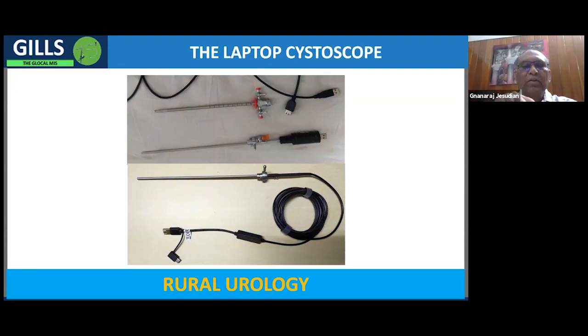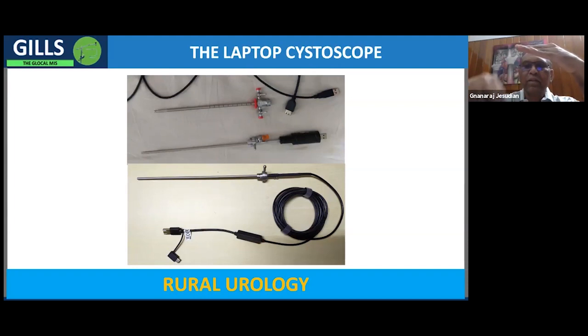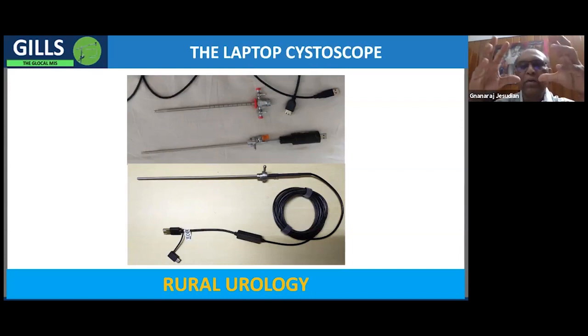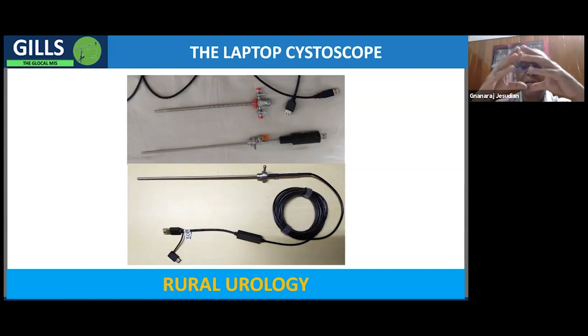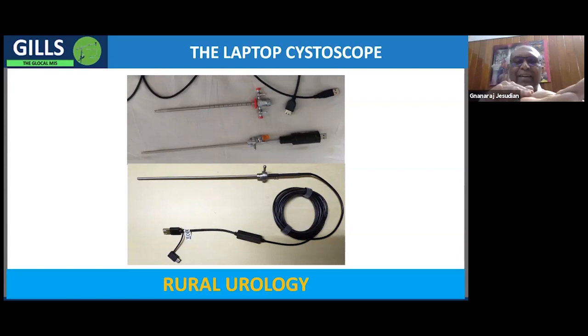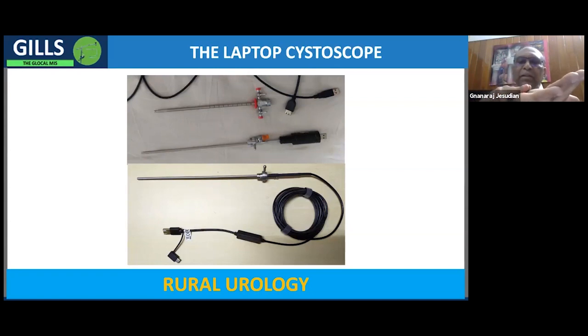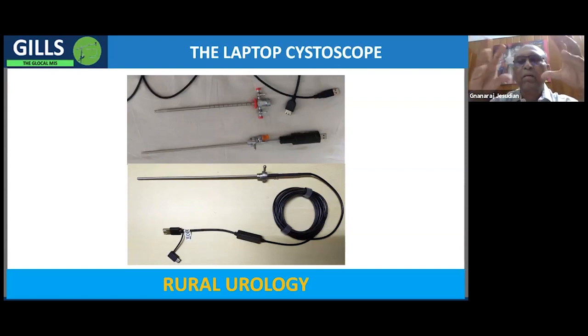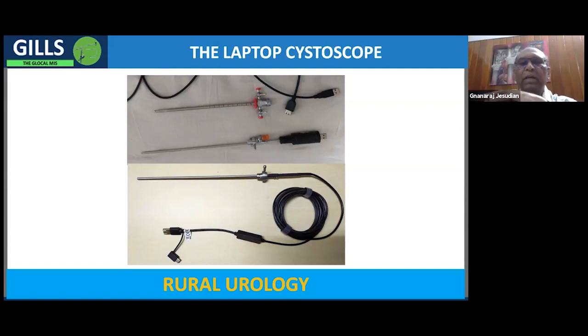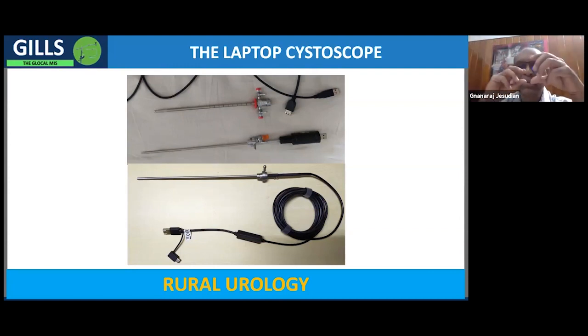Most of the scopes that we use are 30-degree scope. In other words, it will look down, bent about 30 degrees, so the vision is downwards. Here it is 0 degrees, so you have to look straight. But looking straight is good for urethra, whether we have any strictures and other problems. It's easier to look straight. But in the bladder, most of the bladder trigone and posterior aspect is sort of straight, so it might be easier to do with 30 degrees to view down. But here you'll have to move in such a way for the 0-degree telescope. We are trying to see if they have any 30-degree camera or whether we can rotate the camera a little bit and fix it. Right now that is not possible. We'll have only a 0-degree camera and 0-degree vision.